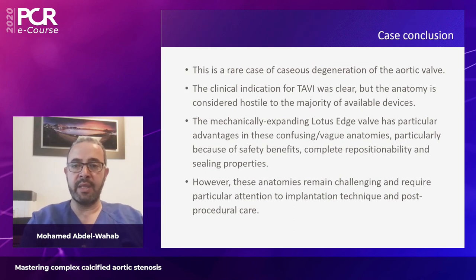This is a rare case of a caseous degeneration of the aortic valve. The clinical indication for TAVI, I guess, was clear, but the anatomy was considered to be hostile to the majority of available devices. We used the mechanically expanding Lotus Edge valve, which could have advantages in these confusing or vague anatomies, maybe because of safety considerations, the repositionability function, and the sealing properties.